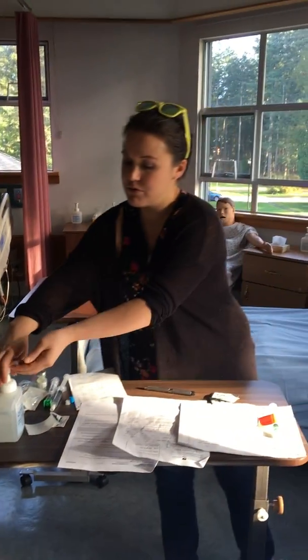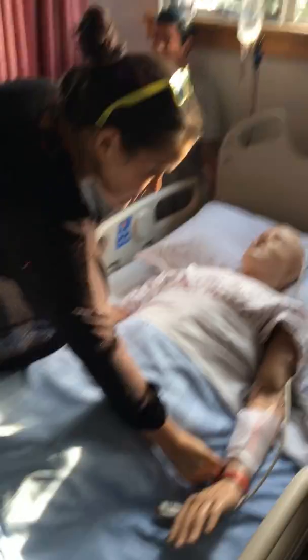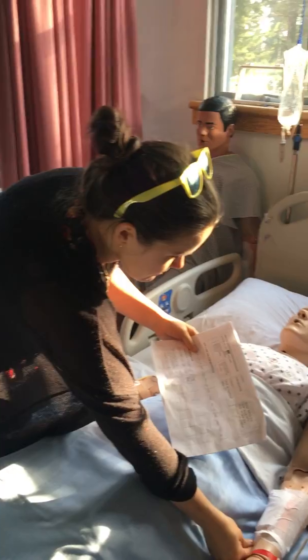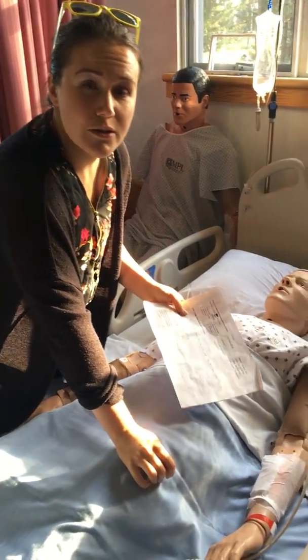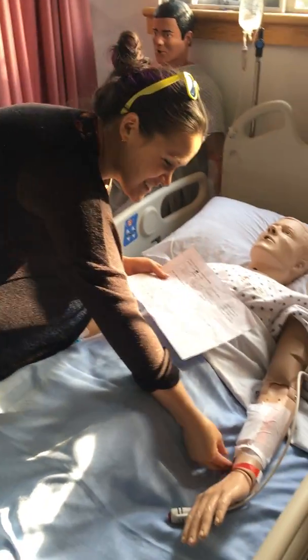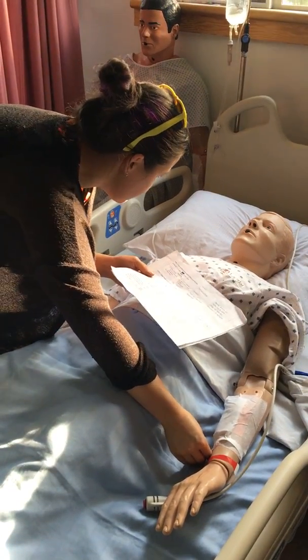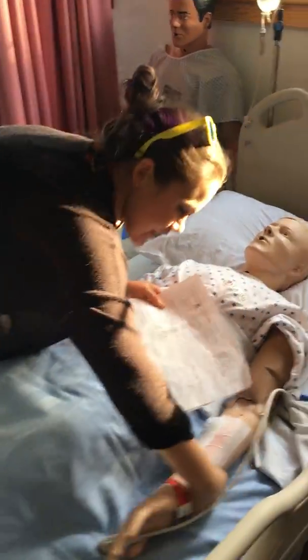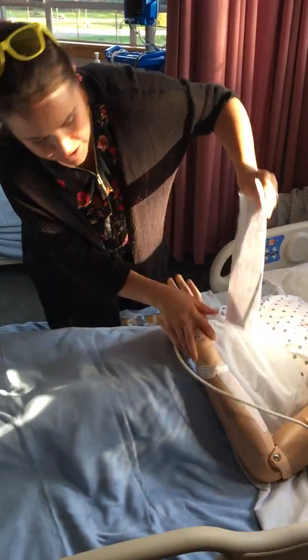When I get into the patient's room, I'm going to introduce myself to the patient. I'm going to check the band and compare it to the MAR, ask the patient their name, their date of birth. They might not answer me because their respirations are low and their sedation scale is too high. And so if she can't answer me, it's going to make it even more important to check her bracelet, so that I can see what her name and date of birth are and compare the MRN.